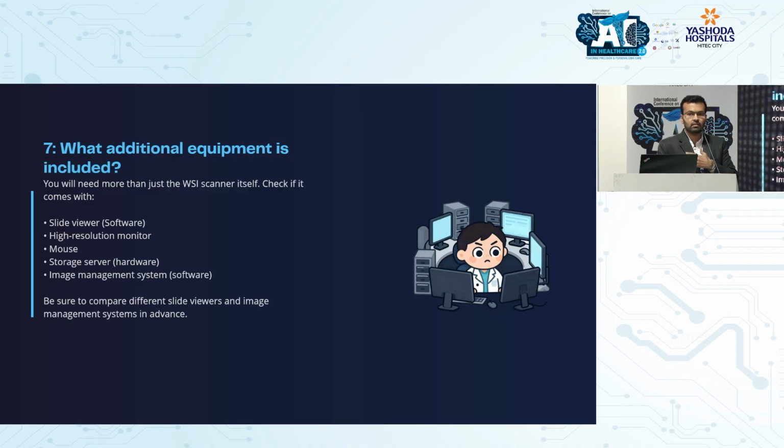So for example, in the lab, we have converted our server itself into a cloud server. So it has got a static IP by which I can access it from anywhere. Then once our data got filled, we added an extra hard drive, another 4 terabyte hard drive, so that added huge storage space for us at no extra cost except for the cost of the hard drive. So these are things which you can do if you have a little bit of technical knowledge, very little.